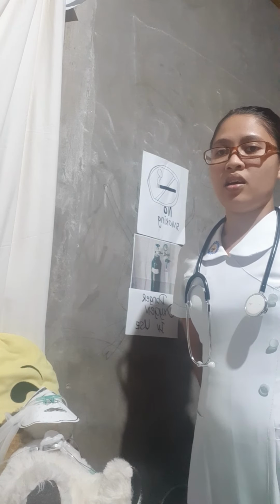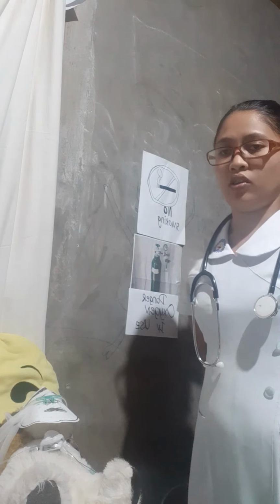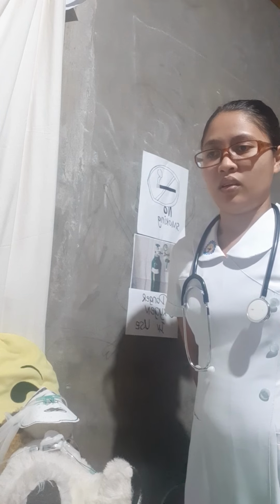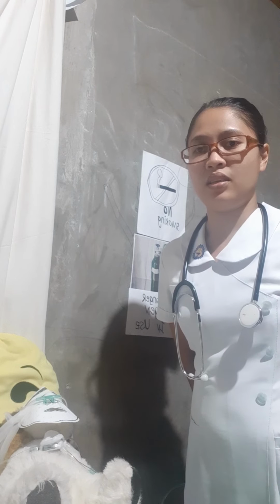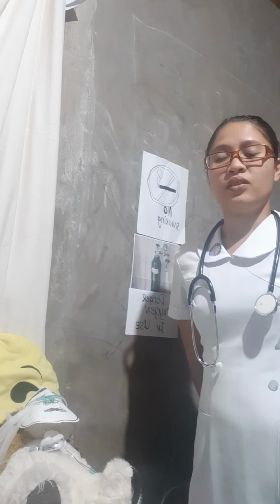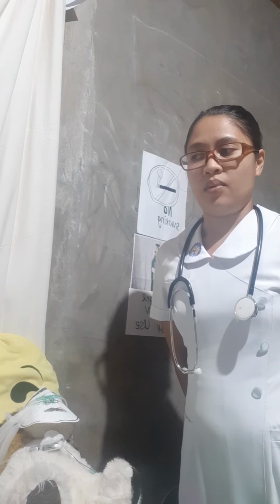Next, for planning, identify the client's identity. For a conscious client, we have to ask him. But if the client is unconscious, we can check the hospital bracelet and ask the patient's relative if they are present, and lastly check the chart to verify the client's identity. Next, we need to determine the need for suctioning. Verify the suction order in the patient's chart.